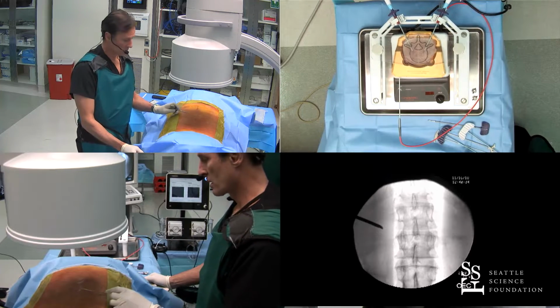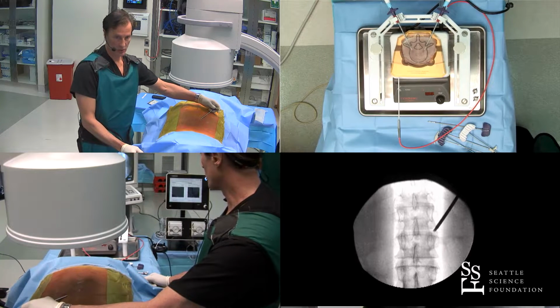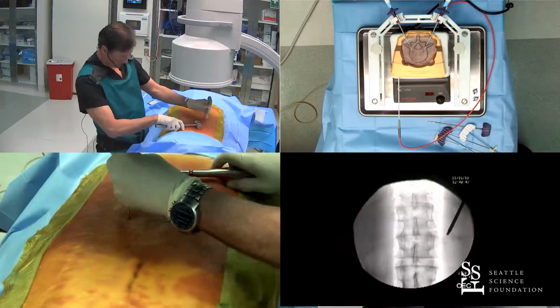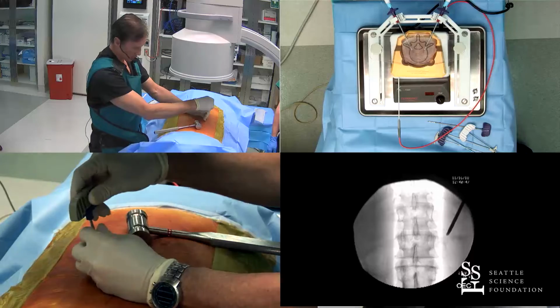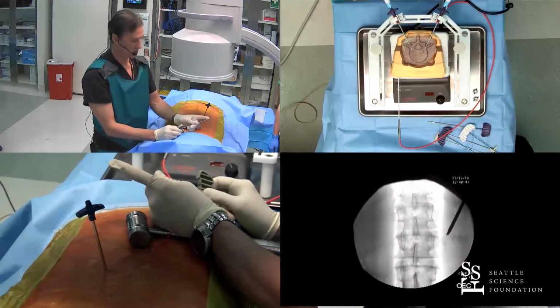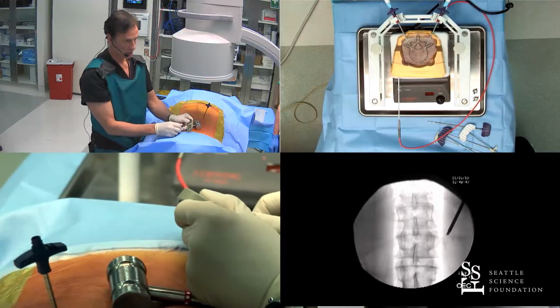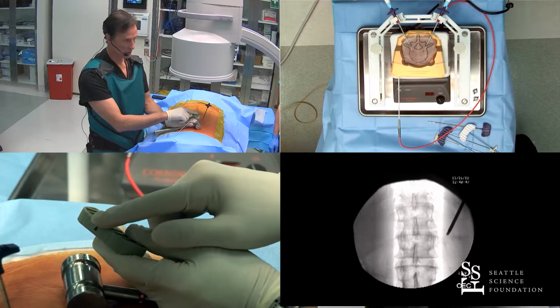All right, so we will access with the transpedicular approach. So the start is a centimeter up, 2 centimeters out. And we will access using the beveled needle. So this is a beveled needle. It has a single directional bevel. The arrow on the tip indicates the direction the needle will go.